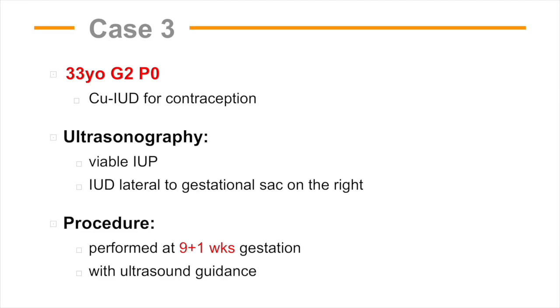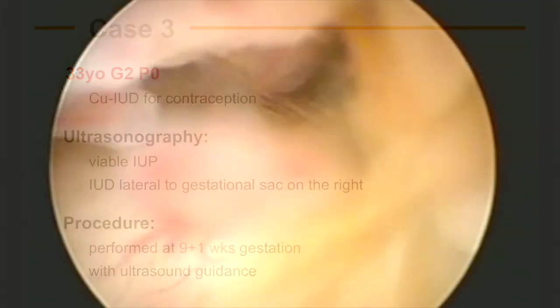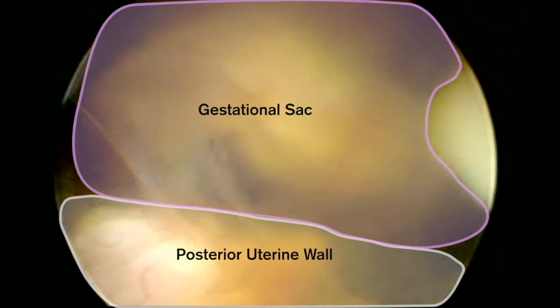Case 3 is a 33-year-old Gravida 2 Para 0 who had a copper IUD removed at 9 weeks and 1 day under ultrasound guidance. In this case, as we obtain entry to the uterine cavity, the hysteroscope is not advanced any further. We then perform a gentle scan from one side of the uterine cavity to the other. This helps facilitate IUD identification without the need to advance the hysteroscope further into the uterine cavity, thus reducing the risk of disrupting the gestational sac.